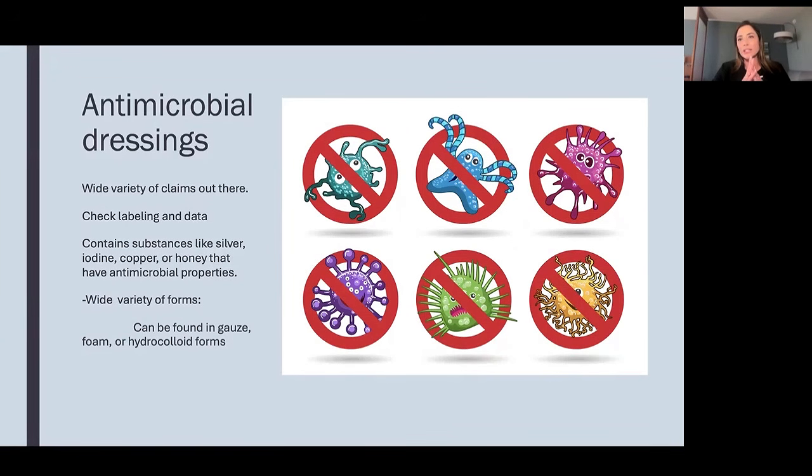I would say silver is the most common antimicrobial dressing on the market today. But iodine, especially Cadexomer iodine, has some really great studies out there and good claims regarding bacterial activity. Really excited to hear about how copper is both anti-inflammatory and antibacterial, and how it's going to help move silver to the side a little bit. Copper is innate in our bodies, and it's an essential element for us.